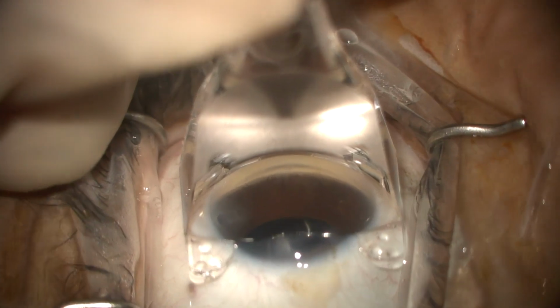You do see there on the iPrism SX those two little clear areas at the top. You have a sort of frosted glass appearance, but you have those two clear areas there. Those are sort of targets that give you 3 clock hours of spacing, because we know we do want to try to place these stents a few clock hours apart if we can. So it's really helpful to have that on the iPrism SX for targeting. You see me sort of pointing that out to you here.